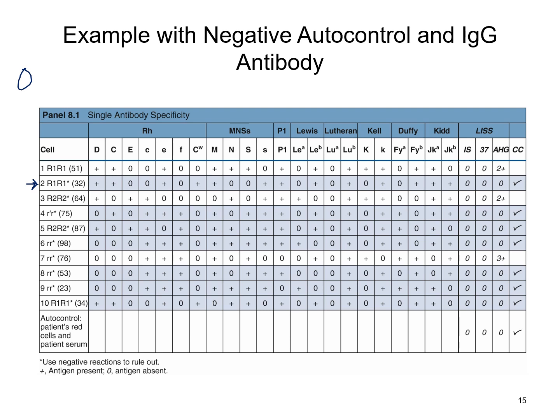And then we know that we've also got some RH negative donors here. But looking at cell number 2, this particular donor has the D antigen. So we know that if we mix this donor with our patient who has an antibody and it did not react, well, we know that antibody is not anti-D, because if it was anti-D, it would have agglutinated. So let's do the rule-out process.